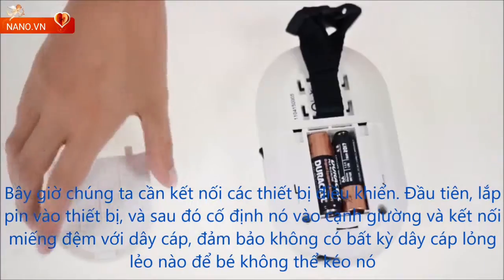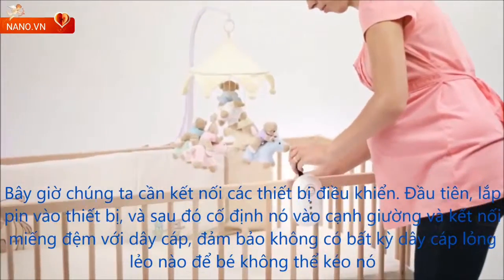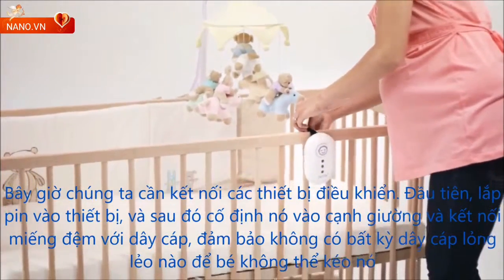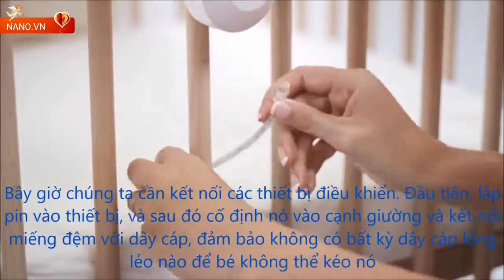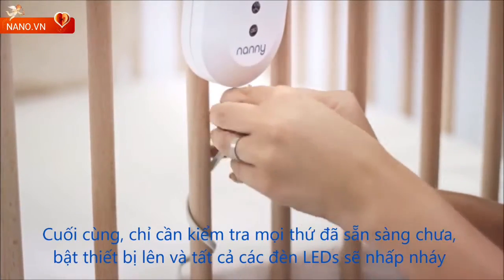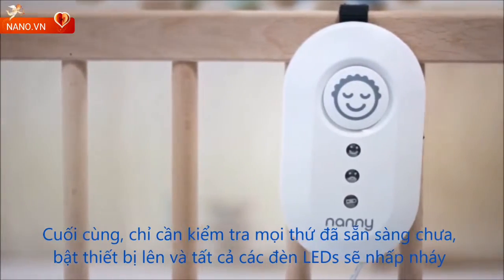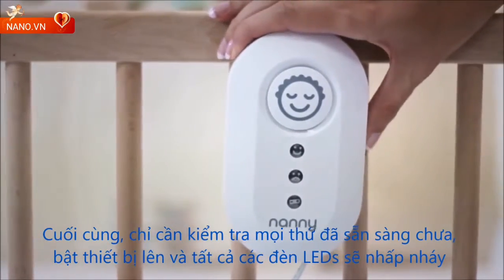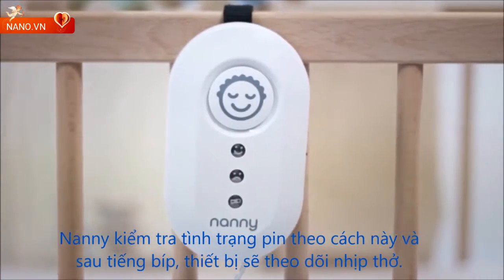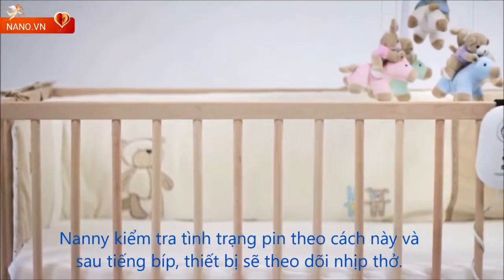Now we need to connect the control unit. First, insert the batteries into the unit and then fix it to the cot and connect the pad to the cable. Secure any loose cable to the cot so the baby cannot pull it. Finally, just check if everything's already as it should be. Switch the unit on. All the LEDs will blink briefly. Nanny checks the battery status this way. After the beep, the device monitors the presence of a breath.